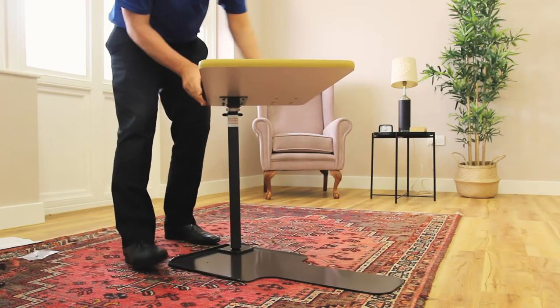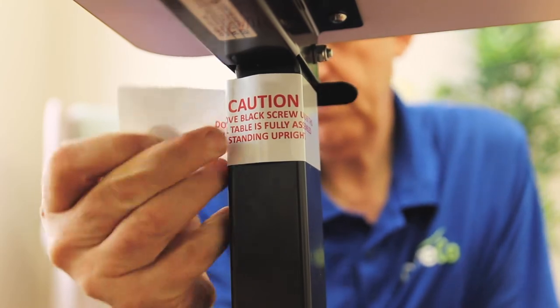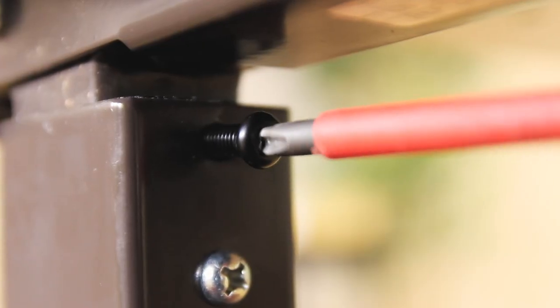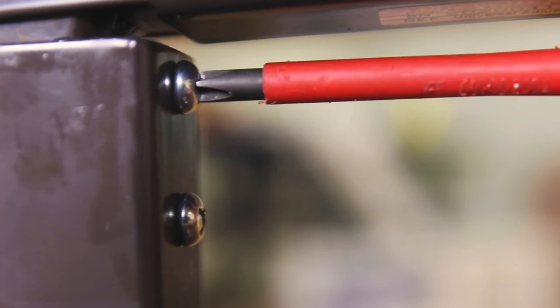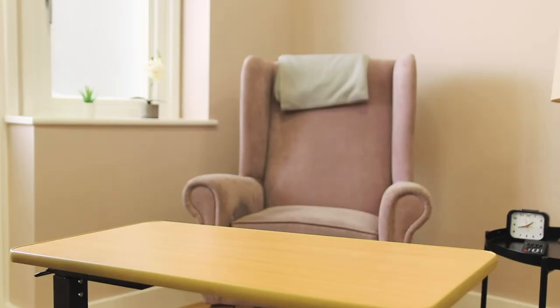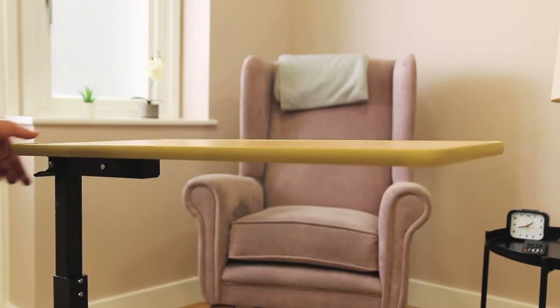Now flip the table so that it's standing upright and remove the safety tape on top of the column. You can now remove the black screw from the top and replace it with the zinc plated screw using a Phillips head screwdriver. This will release the spring loading mechanism that allows you to adjust the height of your table.